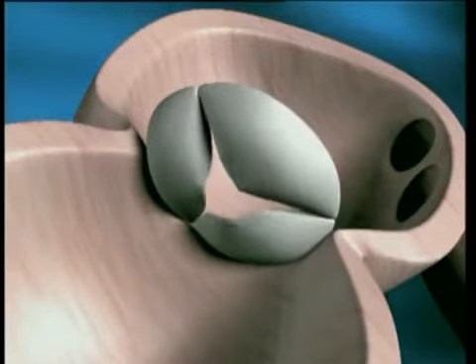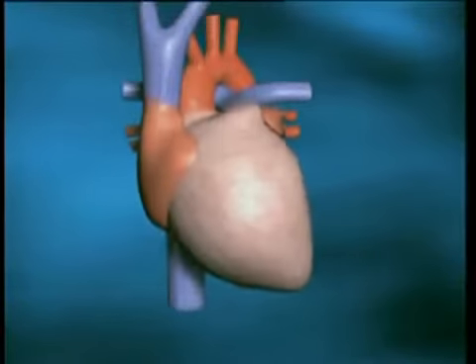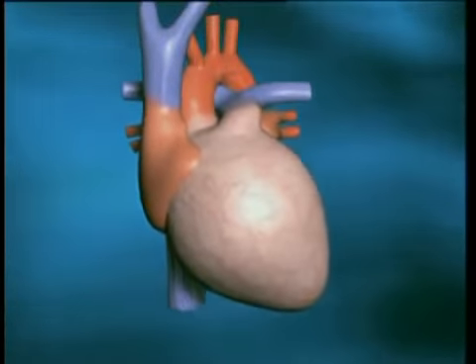Not only do we know that as we age, the waveform changes, or the so-called reflected wave changes. There is a condition called central aortic pressure, which is the pressure at the root of the heart. It is the pressure at which, when the heart pumps, the blood comes out. Now this central aortic pressure is very closely related to the stiffness of the artery.